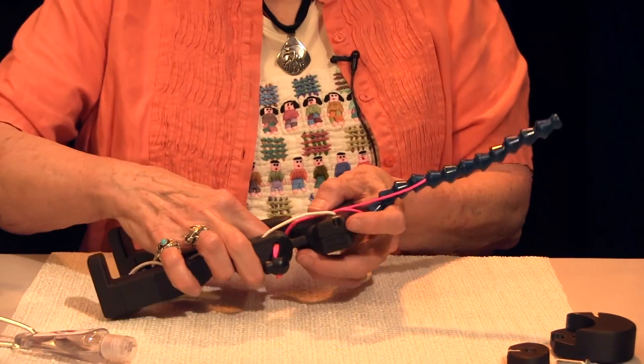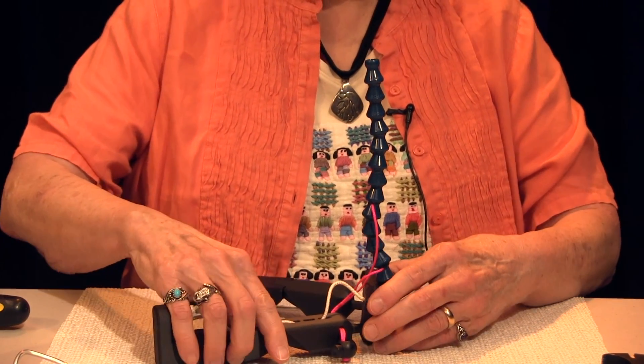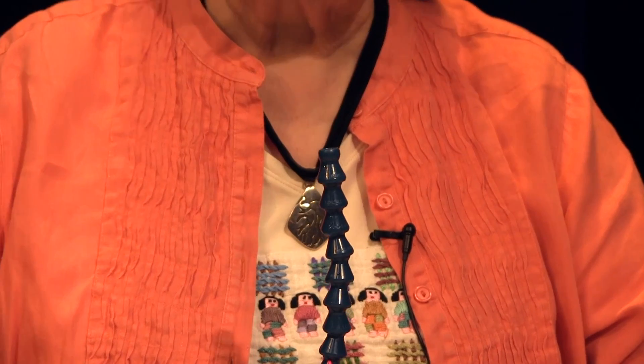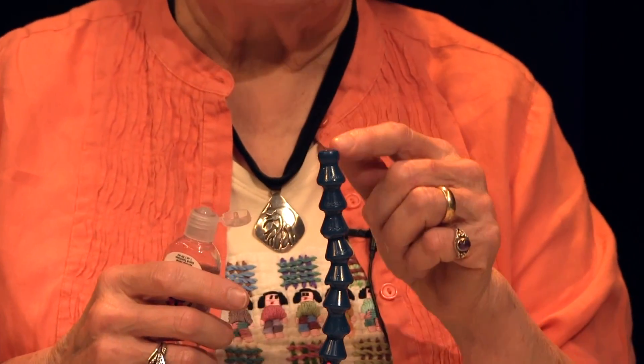Sit HAMI upright with his legs open for a stable position. Use hand sanitizer gel to lubricate the outside of the top bead of the spine.